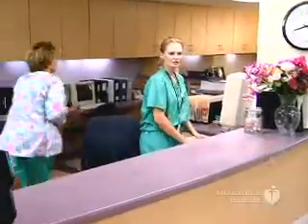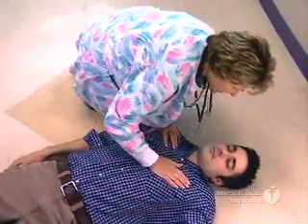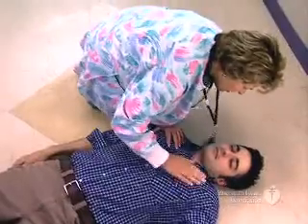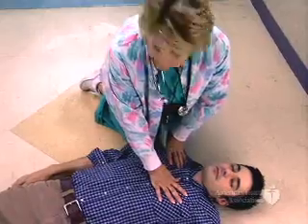If you think someone has suffered a cardiac arrest, first, check for response. Mr. Garner. Mr. Garner, can you hear me? If the victim does not respond, one rescuer should activate the emergency response system and get the AED. Pam, call 911. Barbara, get the AED stat.